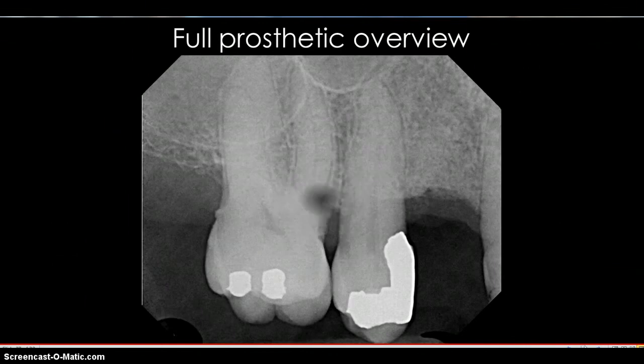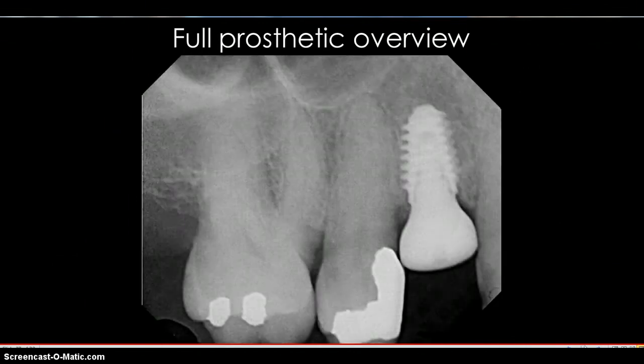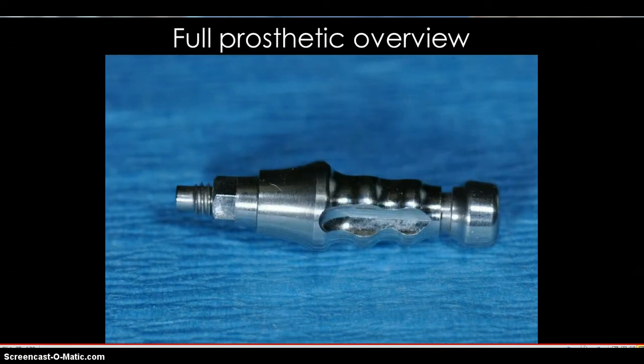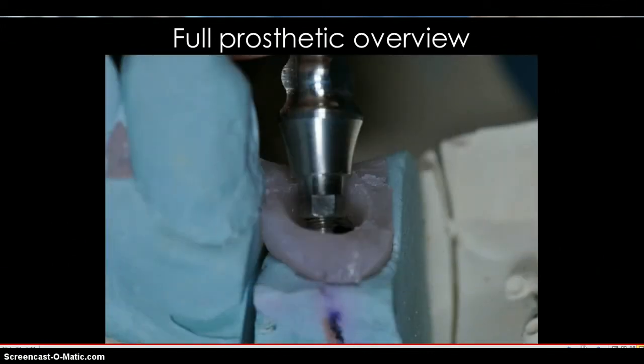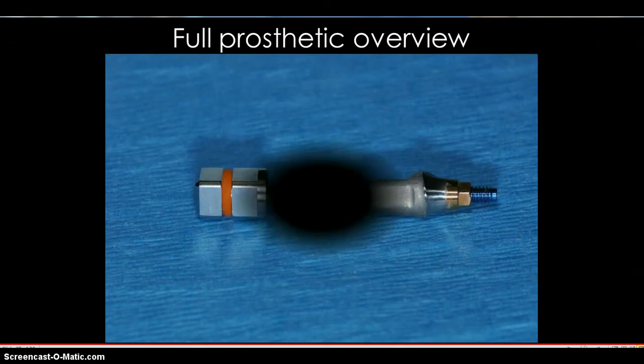So let's look at this case here. Here the implant has been placed. Second stage was done. Healing abutment was placed. Impression coping utilized to take the final impression. Here you can see the soft tissue model on the lab working model itself. You see the internal hex there. There it is seated. Nicely placed.